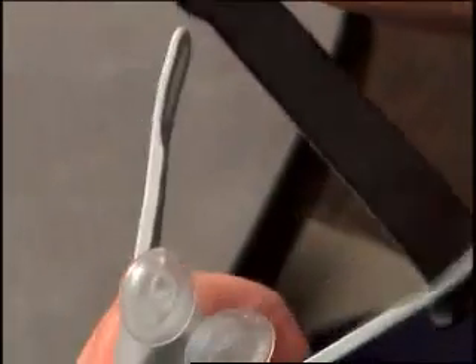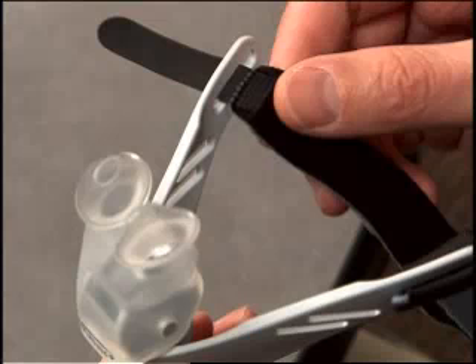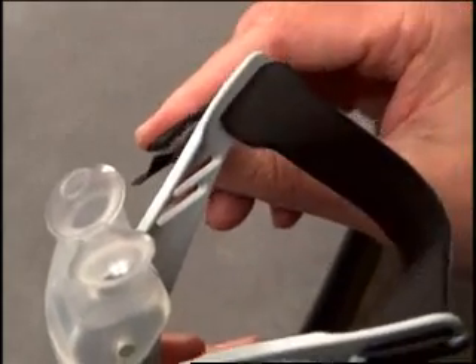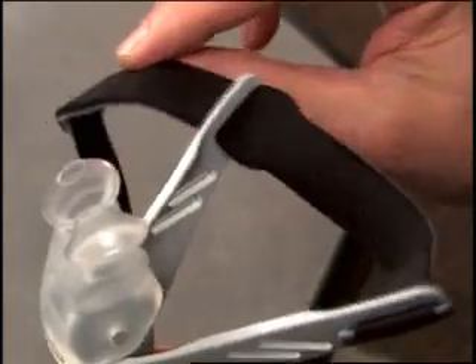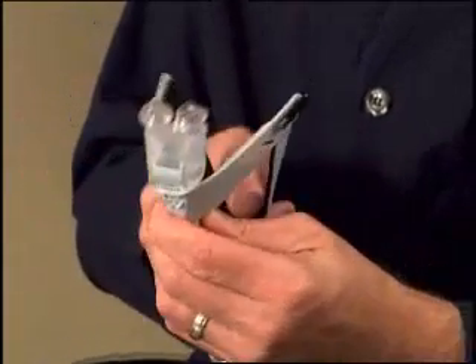The other end of the band is wider and thicker and cannot be completely pulled through the slot. Next, insert the end with the thin black headgear tab through the horizontal slot on the other side of the interface, inserting the band from the inside of the interface to the outside. The wide portion near the center of the band should not be pulled through the second slot. Loop the end of the tab down and attach it to the blue side of the band.